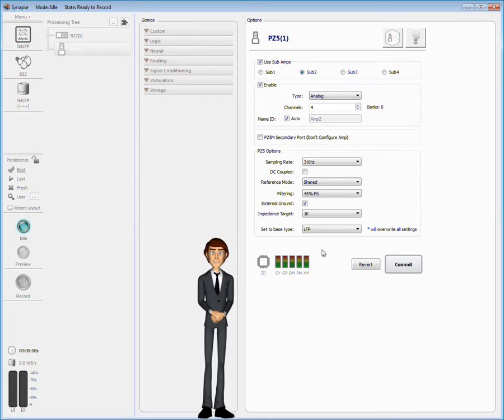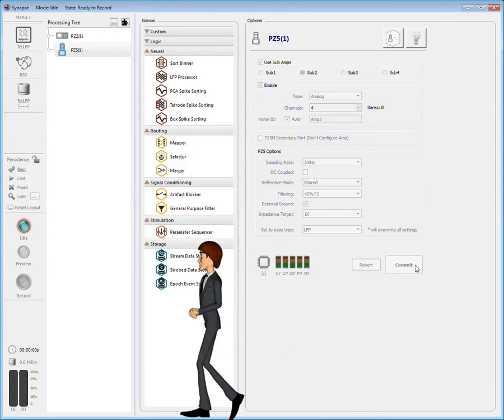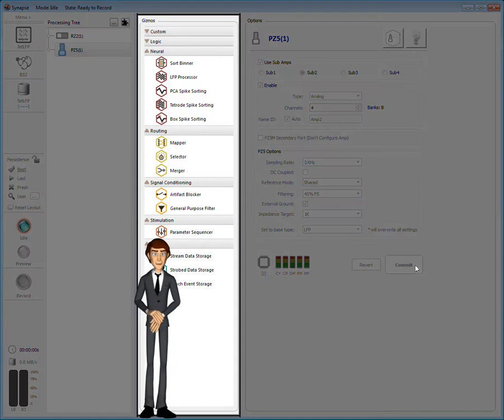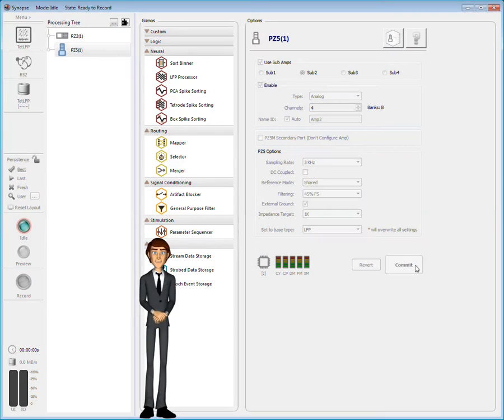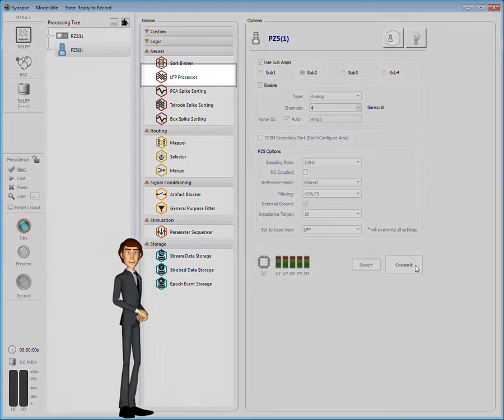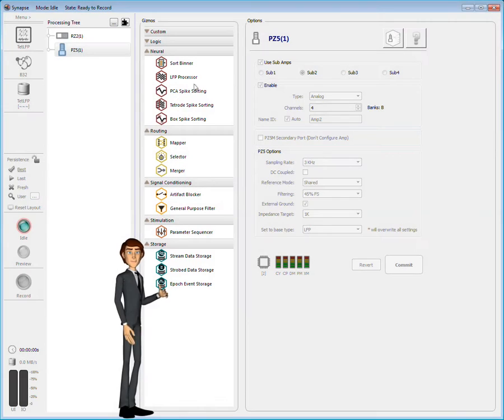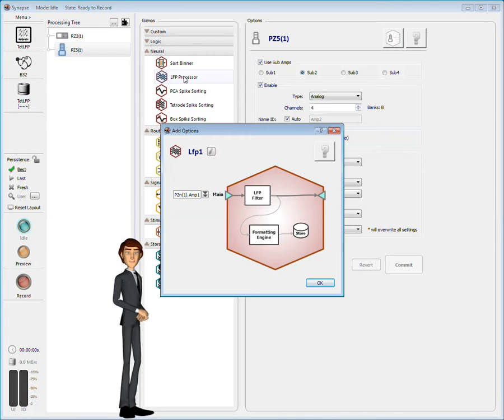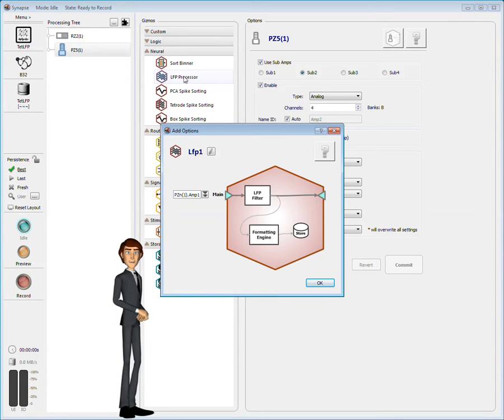Now that the PZ5 is configured, it's time to add the gizmos. There are gizmos for many different tasks. I'll start with the LFP filtering gizmo from the neural group.